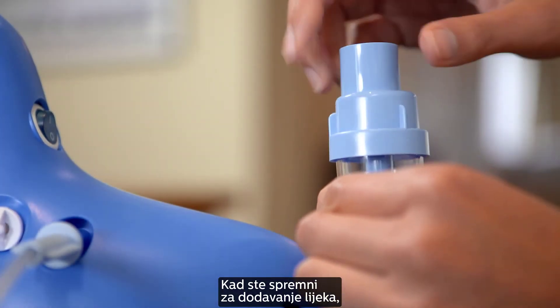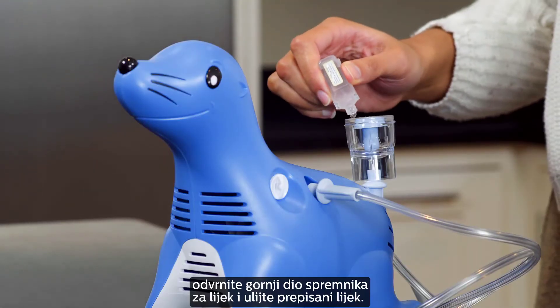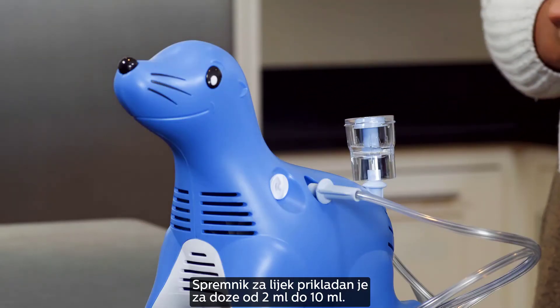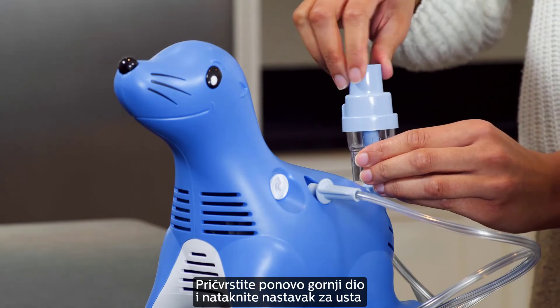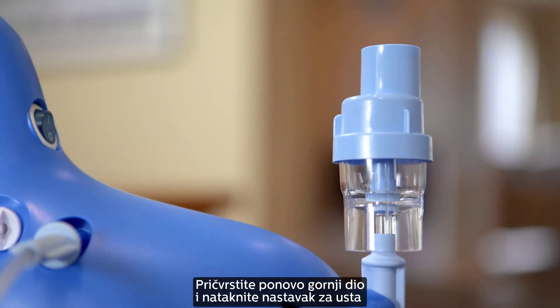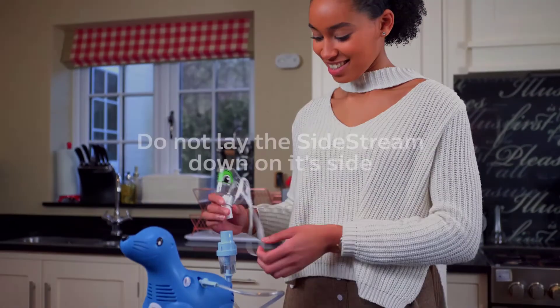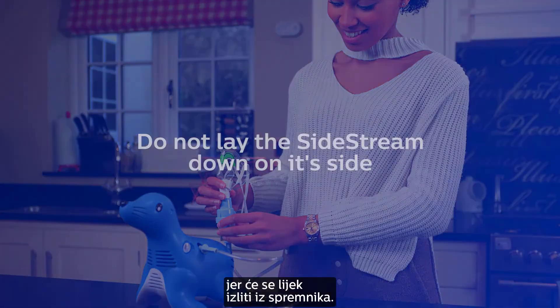When you are ready to add the medication, unscrew the top of the Sidestream nebulizer cup and pour in the prescribed medication. The Sidestream nebulizer cup is suitable for 2ml to 10ml doses. Screw the top back onto the nebulizer cup and attach either the nebulizer mouthpiece or the Tucker the Turtle mask. Do not lay the Sidestream down on its side because the medication will spill out.